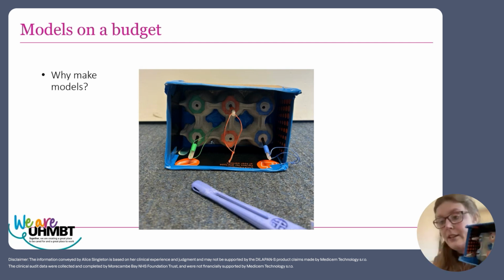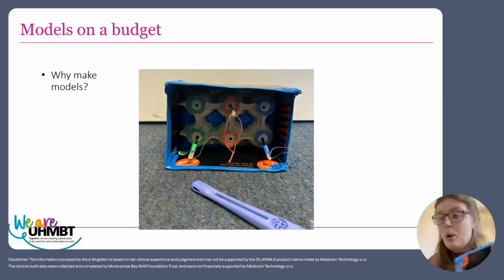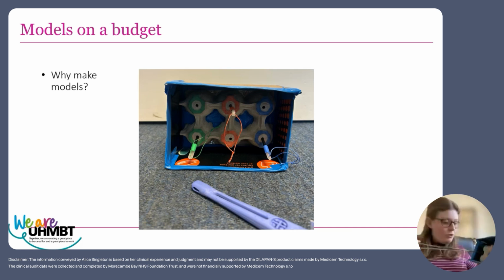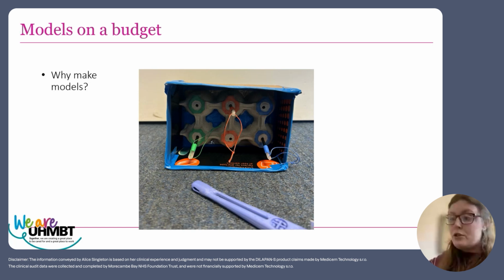So these are just Dilapan sticks I put in. I hope you can see this okay. So I put a little picture of the same one on the board. It's an egg box. That's what it is. I've just pierced holes into the top of the egg box, and basically what I use it for is people to practice. Sorry, I'm losing all my Dilapan sticks now. They can clip on the sponge holding forceps and they can try and insert into the cervix, and then you can just check doing and undoing the forceps and get used to doing it before they have to do it with a real patient.